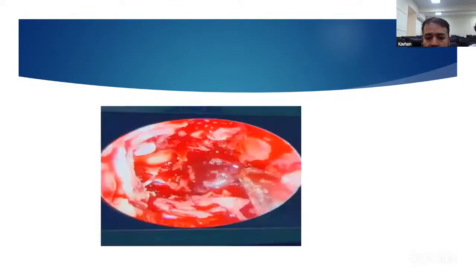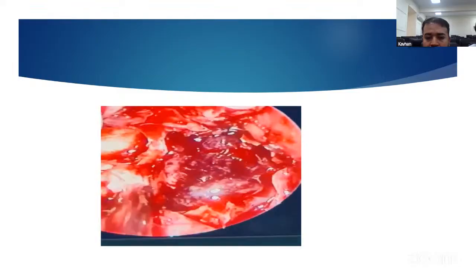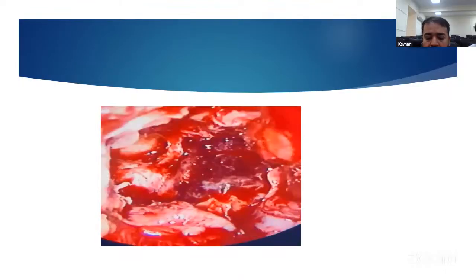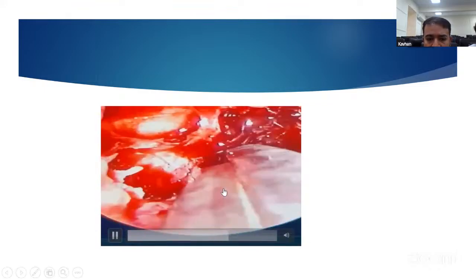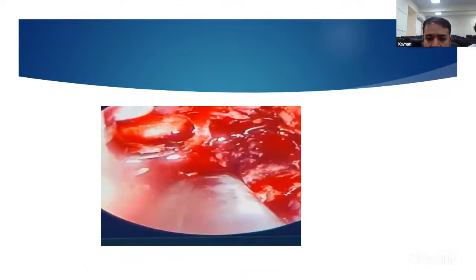The lesion was invading the sphenoid sinus. Before giving a cruciate opening to the dura, the lesion was inside the sphenoid sinus, and we removed it to the extent of the lesion. And Alhamdulillah, the patient did well, and it was a pituitary adenoma in his histopathology as well. This is the septostomy and sphenoidotomy of the lateral portion for a wide exposure.